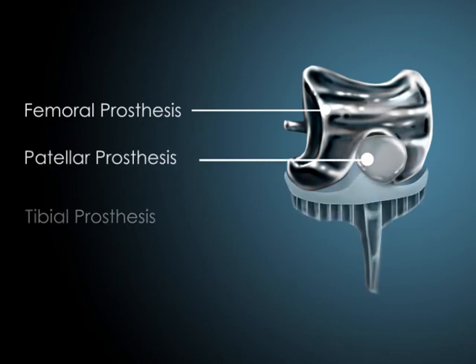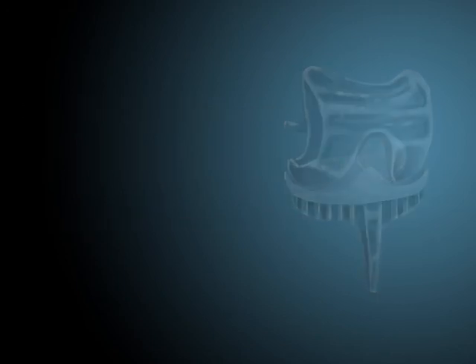There are three prosthetic pieces — a femoral, patella, and tibial prosthesis — that are then put into place.